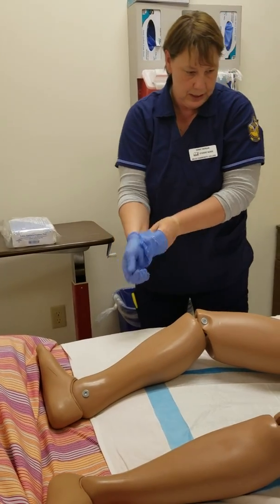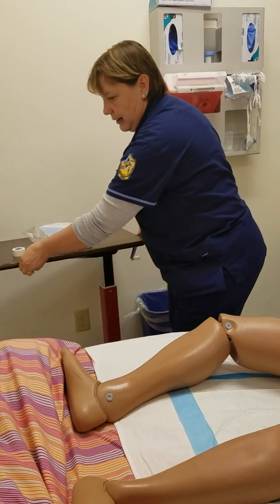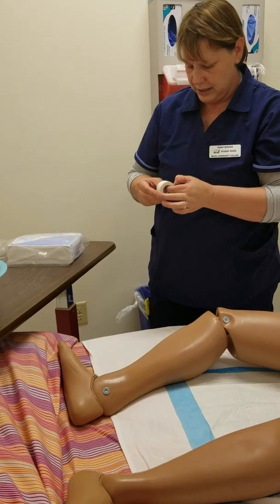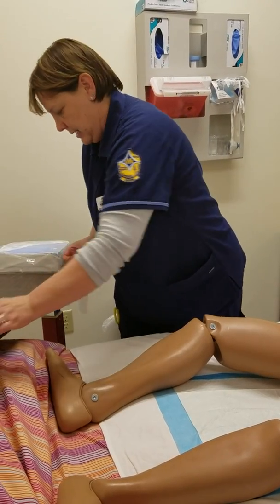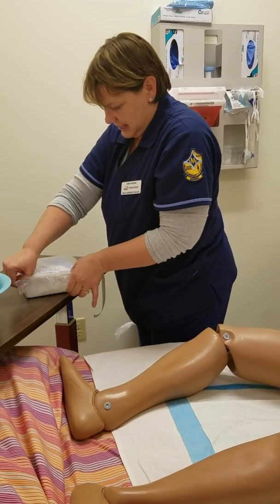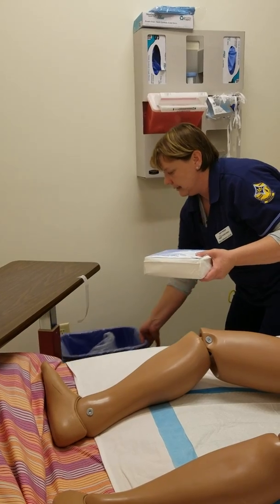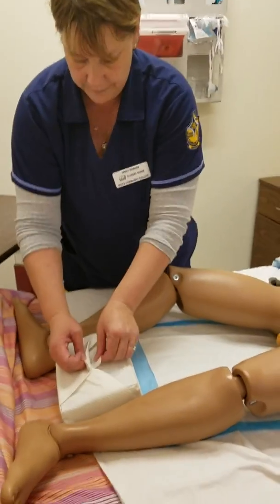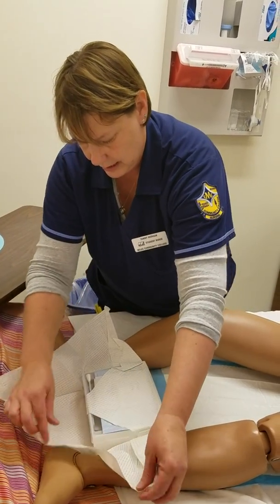When I'm done with that, I'm going to take off my gloves and wash my hands, and get everything prepared to do the catheter. First I'm going to get my tape ready — it's sometimes hard to manage with gloves on, so I'll get it set up and attach it to the stand. Then I'm going to go ahead and open my catheter kit, being very careful not to compromise the sterile contents inside. I'll place the kit down and open it up, touching only the outside edges so as not to compromise the sterile field.